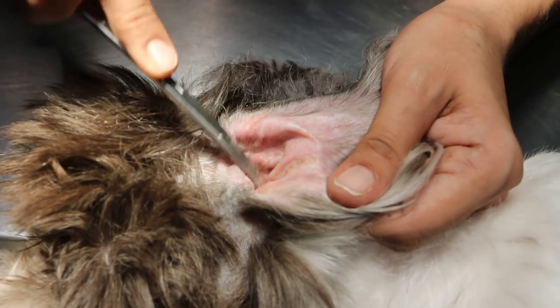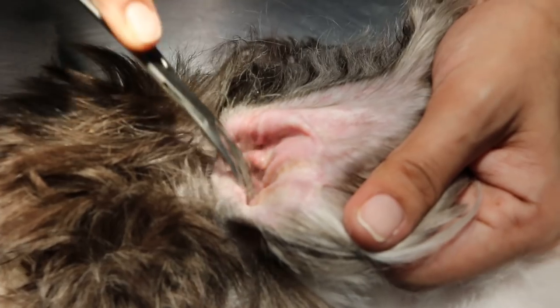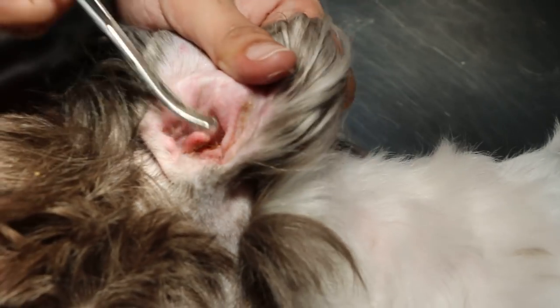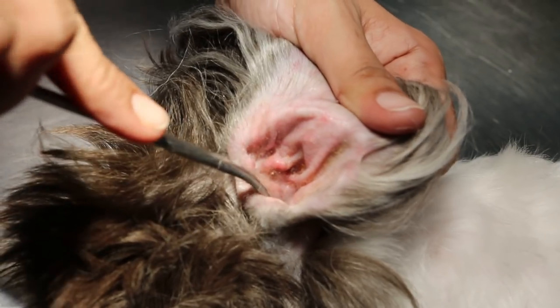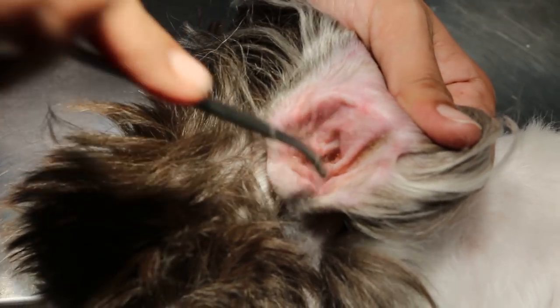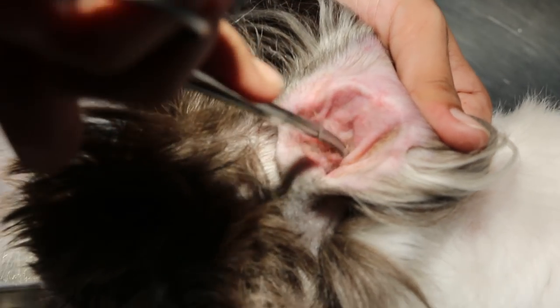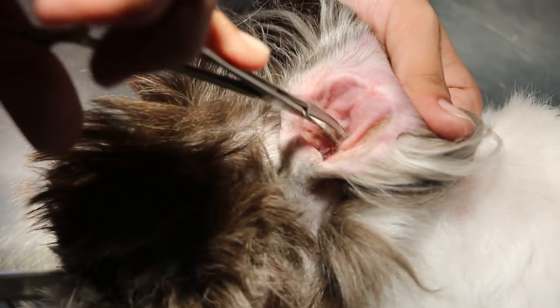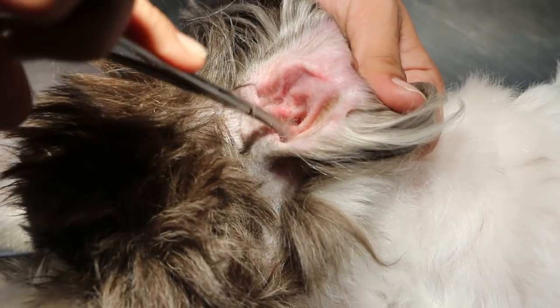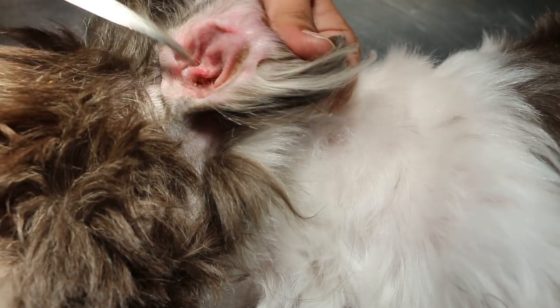During that time you can irrigate the ears. The left ear is definitely inflamed — something might have dropped in during the Christmas period last week because the dog likes to go under the Christmas tree. This left ear is very itchy, so we pluck the hairs first.